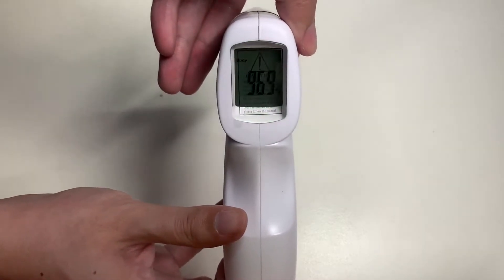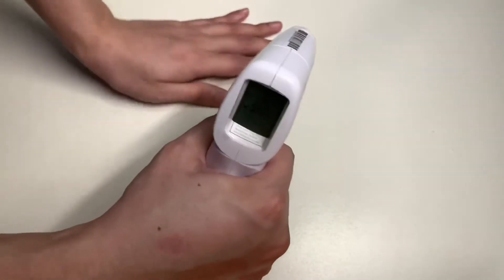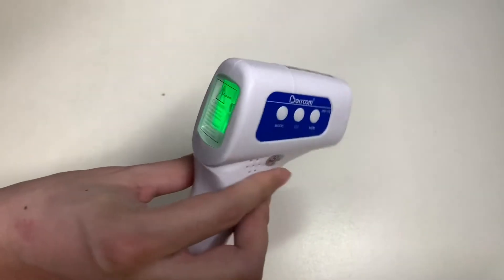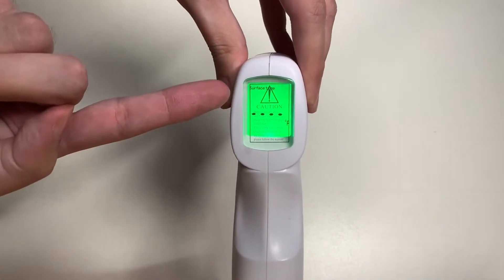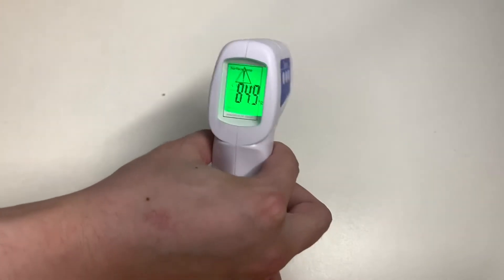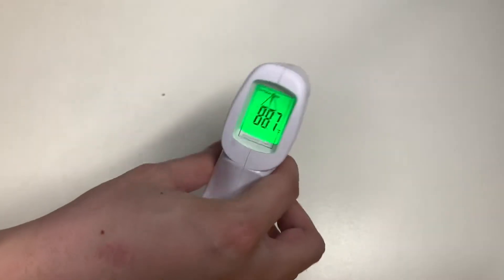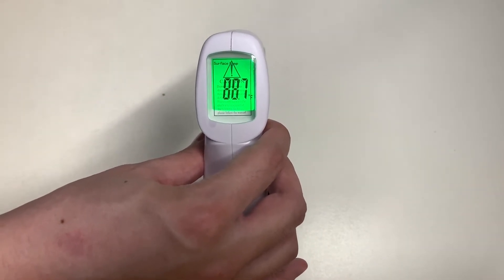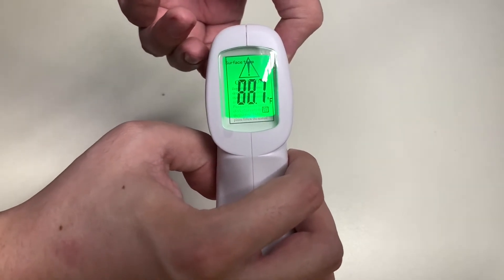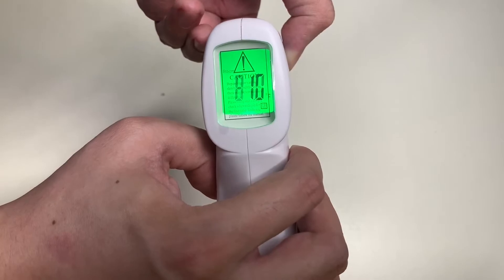You can change the mode — we have body mode and now we have room temperature mode. For room temperature mode you don't have to point at anything; it just measures the temperature of the room you are in. It reads 81 degrees in this room we are recording in. You can also change mode to surface temperature — we took a measurement of the table, and then the camera lens reads 88.7 degrees. This button lets you scroll through up to 32 previous temperature readings.